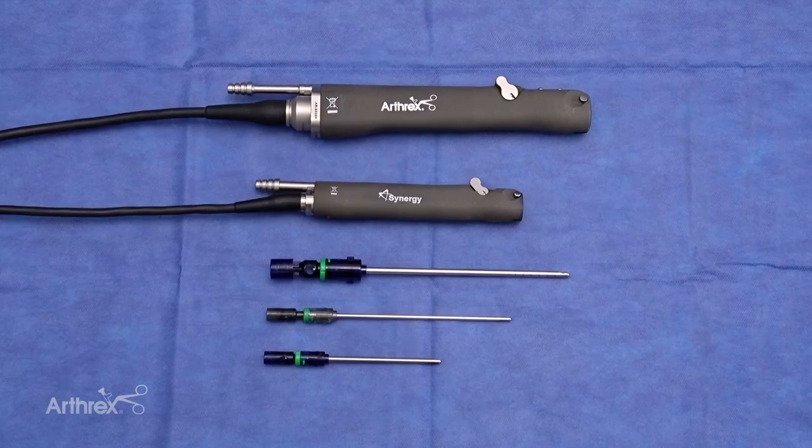Hi, my name is Eric Ferkel. I'm an orthopedic surgeon from Los Angeles, California at the Southern California Orthopedic Institute. Today we'll be discussing the Nano Sabre Shaver.